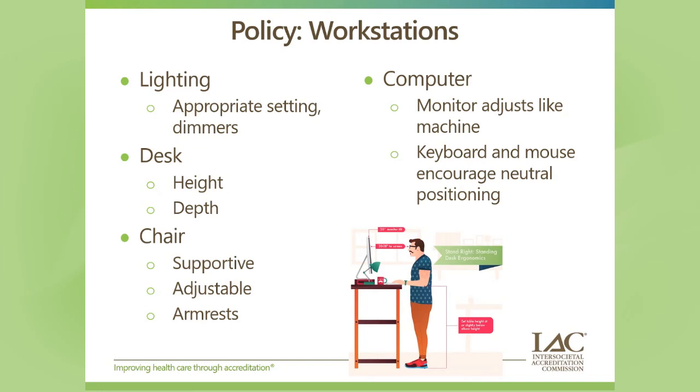It also gives them an opportunity to work different muscles and take pressure off if we get fatigued from sitting in a chair. But set up that standing desk in the same fashion we would for sitting, as you can see with this person here, that they're at eye level to the screen and have appropriate tilt and everything.